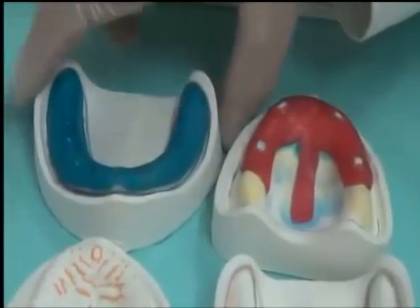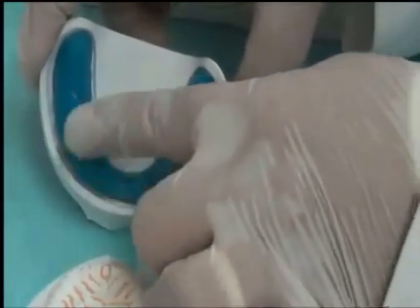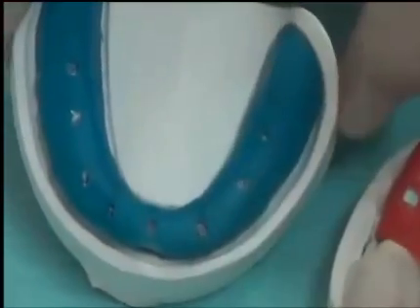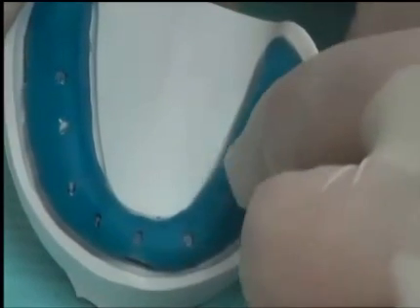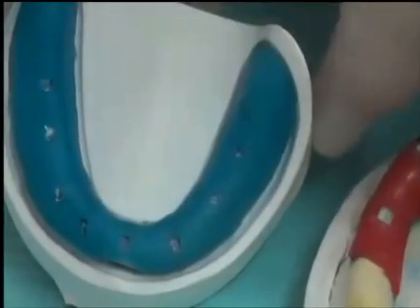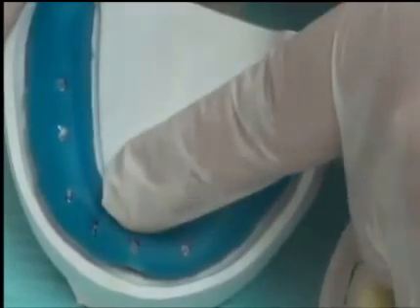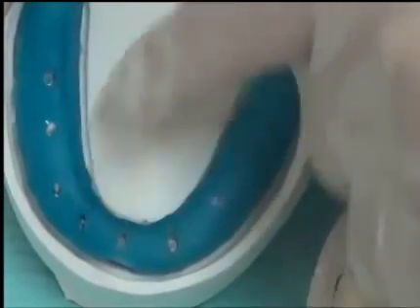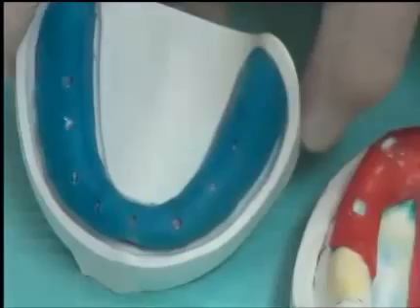Or we can fabricate a tray that has no spacer in it, but in the areas we need relief, just before adding the handle, we put in holes. Under impression, the impression material can escape from these holes and the pressure beneath will be reduced. While on the slope area where no holes are present, the impression material is compressed between the tray and the tissue, and we will have a tissue compressive status. So tissue static here, tissue compressive here.